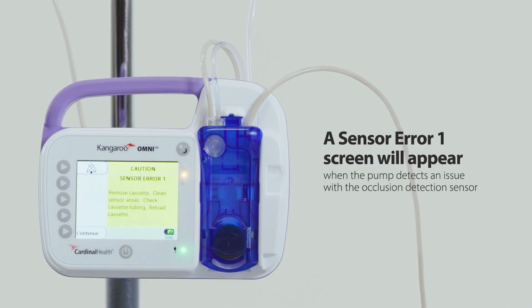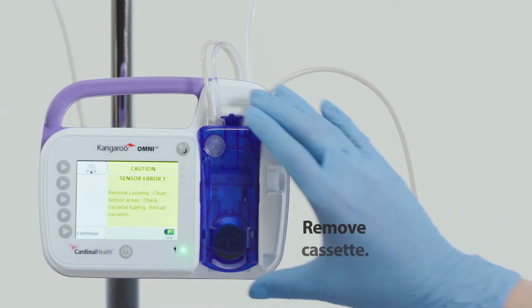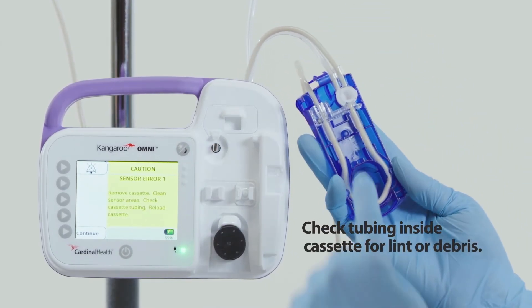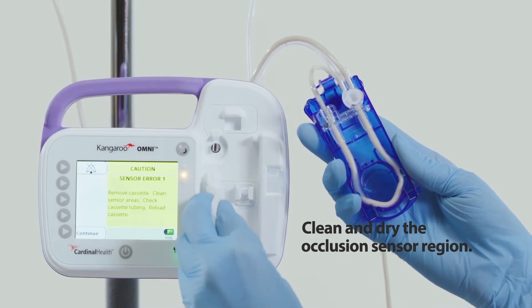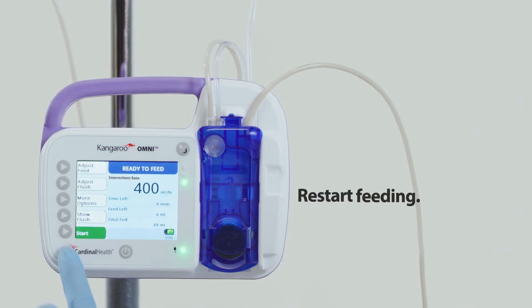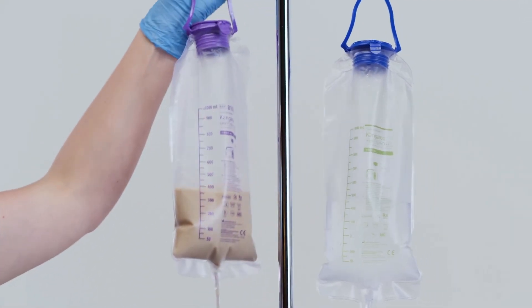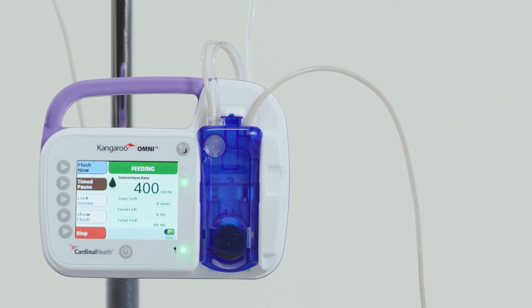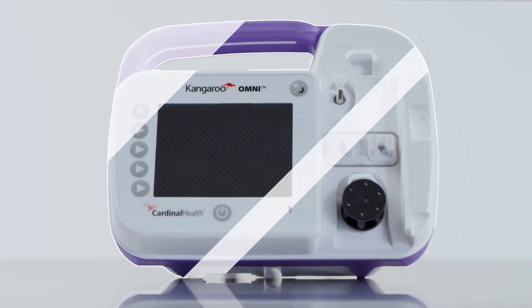Sensor error one alarm: a sensor error one screen will appear when the Kangaroo Omni enteral feeding pump detects an issue with the occlusion detection sensor. To resolve the alarm: first, unplug the pump from the electrical outlet. Second, remove the cassette. Third, check the tubing inside the cassette for lint or debris. Fourth, clean and dry the occlusion sensor region. Fifth, reload the cassette. Sixth, press continue. Seventh, restart feeding. If the alarm continues, replace the feeding set. If it still continues after replacing the feeding set, press power off and use a different Kangaroo Omni enteral feeding pump.